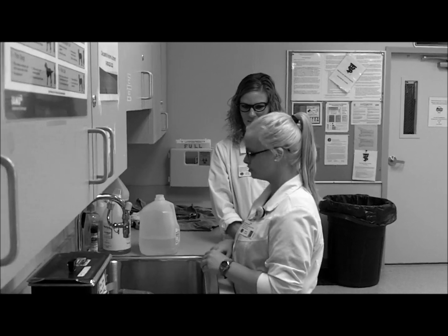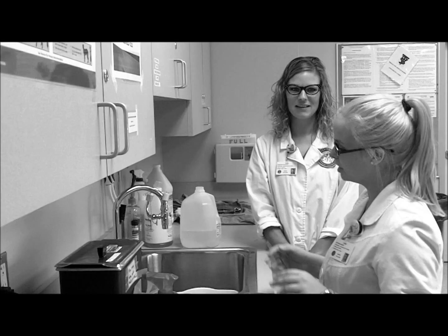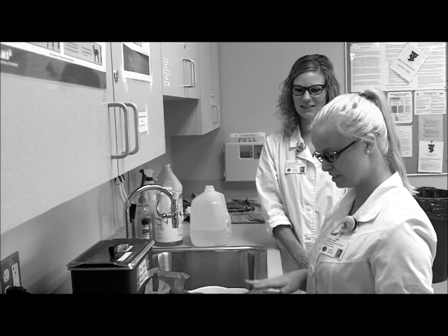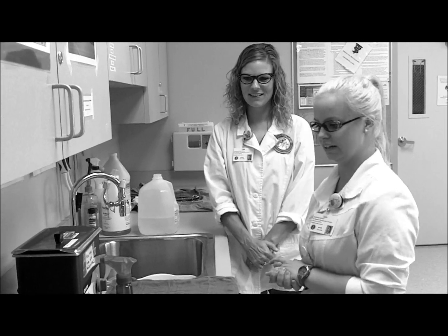Next, we scrub our instruments, making sure to get in all the nooks and crannies. Then we move to the ultrasonic cleaner where the tools are put in for 15 minutes. After that's finished, we set them out to dry and we spray the moving parts with the milk bath to make sure they're lubricated.